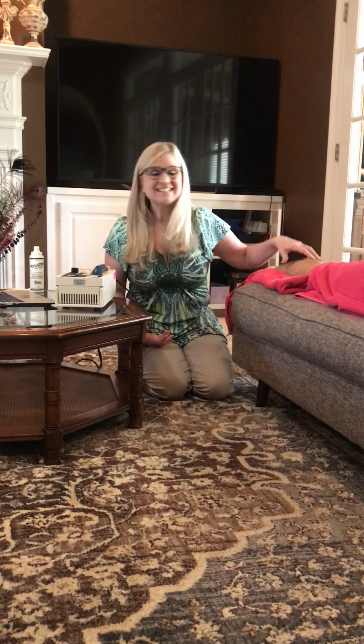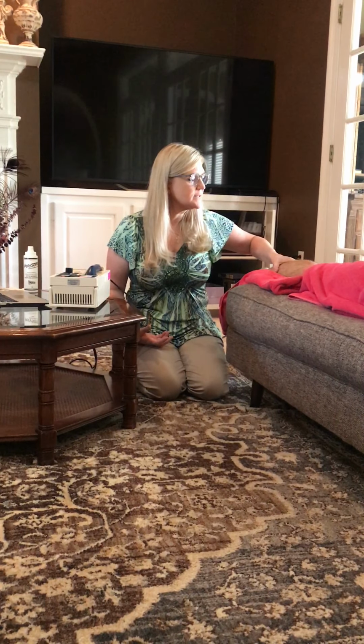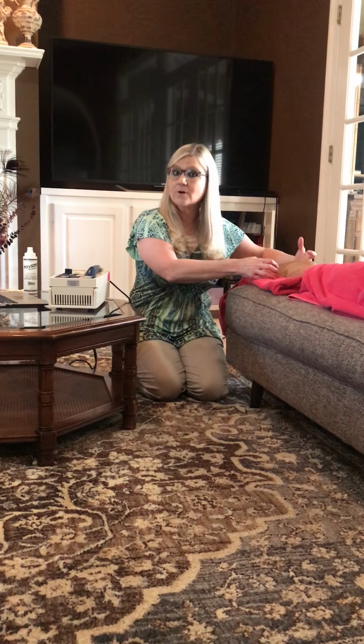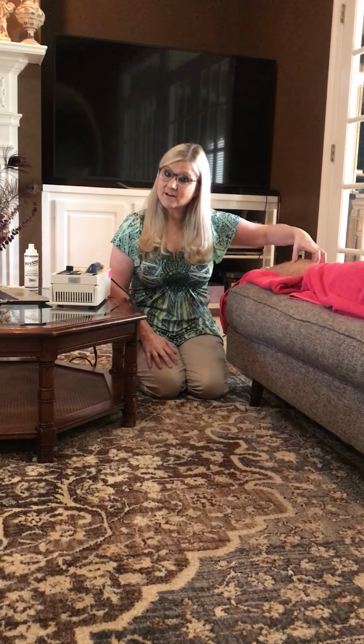So I picked a patient who actually needs tissue heating and needs increased tissue extensibility of the calf muscle, the gastroc. So we're going to use our parameters of 1 megahertz frequency to go for a deeper penetration of treatment. Our intensity parameters can be anywhere from 0.5 to 2.0 watts per centimeter squared for that one. We want to be in a continuous mode to get thermal effects, remembering that we also get non-thermal effects when we do that as well.